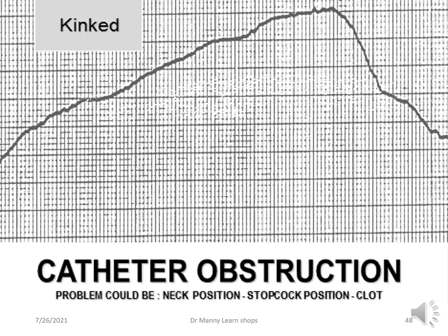Then you've got catheter obstruction, where the catheter is actually kinked, and this could be a manual problem in relation to the neck position, or it could be the stopcock is turned in the wrong way, or there could actually be a clot or a kink.